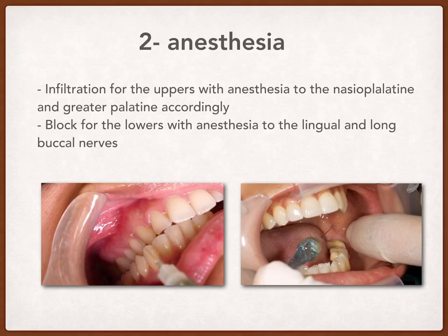By inserting the needle a little bit lingually, you will anesthetize the lingual nerve, and by inserting the needle near the cervical area of the lower 7 or lower second molar, you will anesthetize the long buccal nerve.